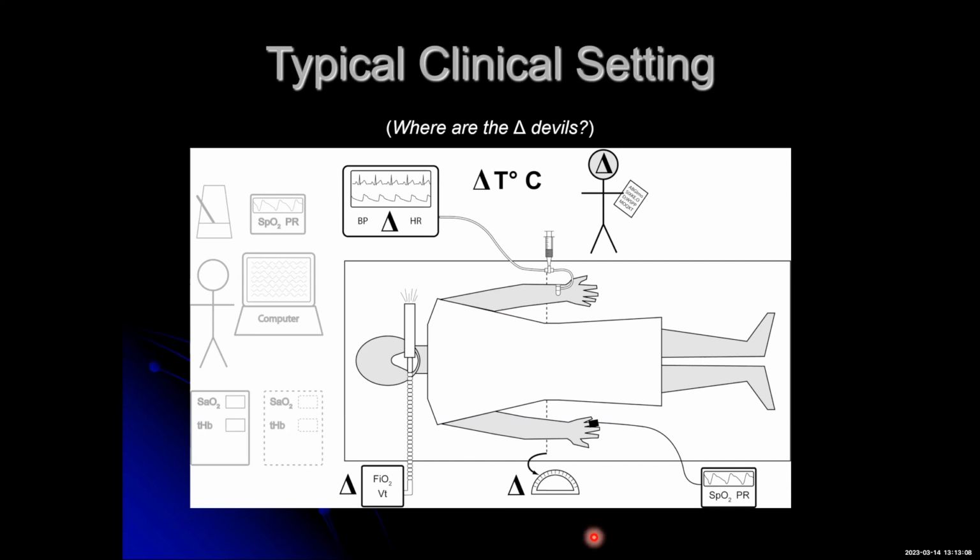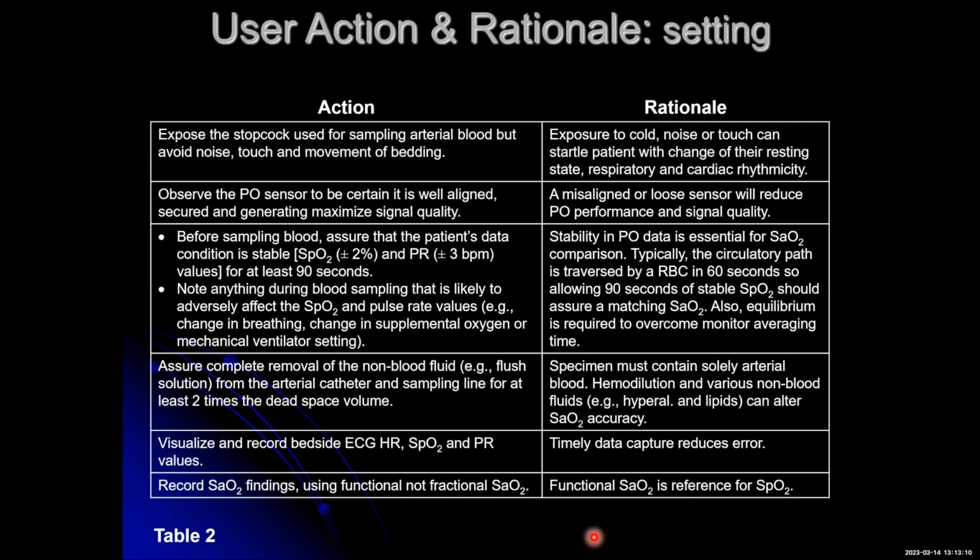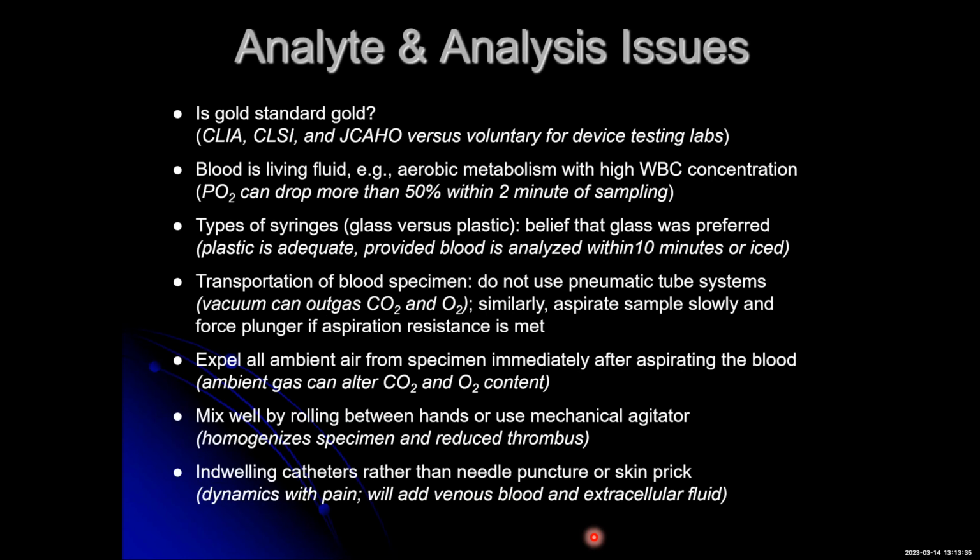And so ventilation and perfusion mismatching can be present. So these are a list of tableized issues that are known to present in real world conditions where it too should be optimized. And thank goodness for Equiox and other studies that have taken into consideration those kind of challenges.